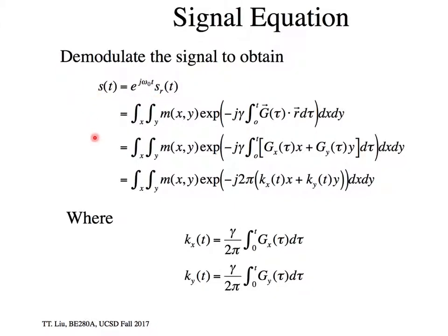So we've jumped straight into the math of how the sample itself creates a time domain signal that we sample, and its relationship to the applied gradients and the position of the object. So if we're trying to reconstruct an object which is MXY, a two-dimensional object, say we've done a slice selection in Z, and we want to produce a picture which is the magnetization vector as a function of X and Y.